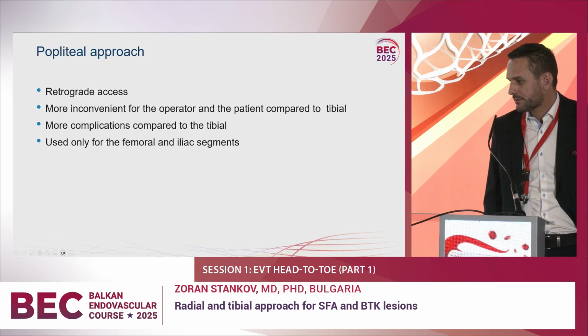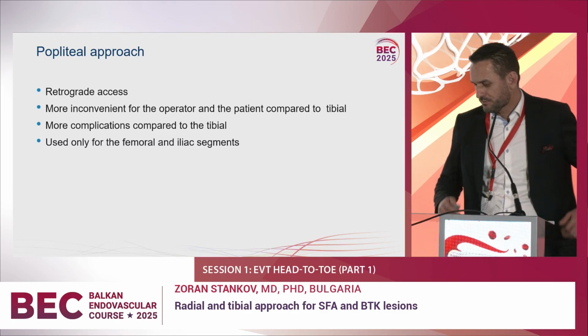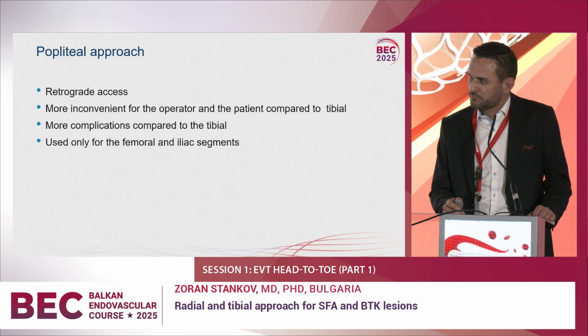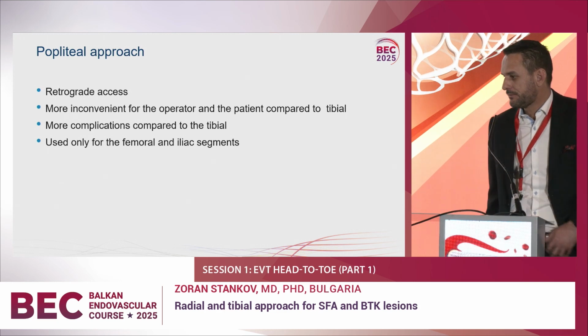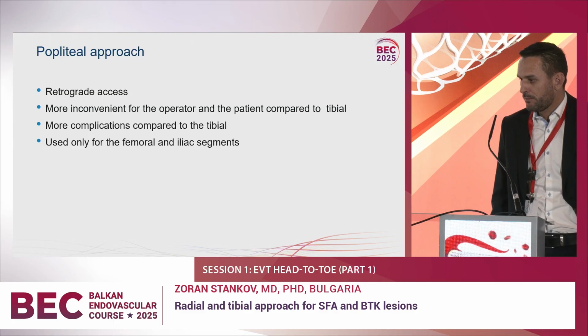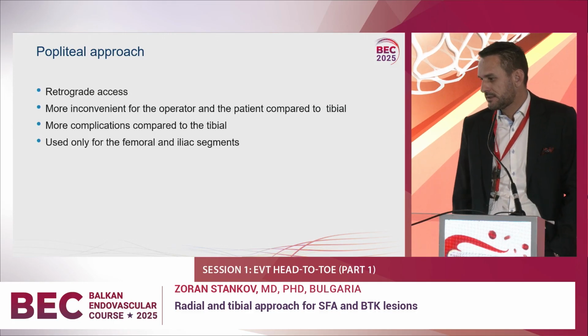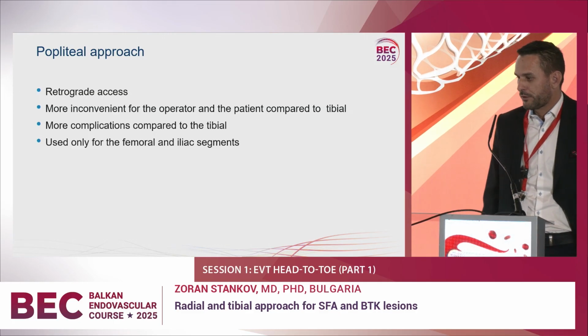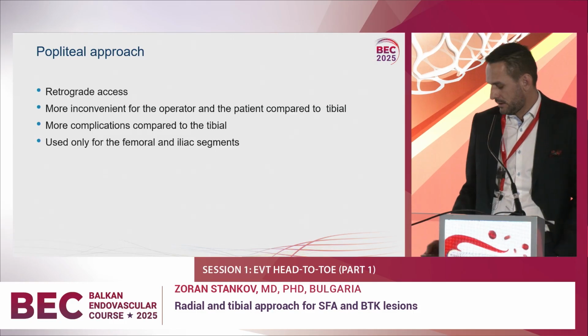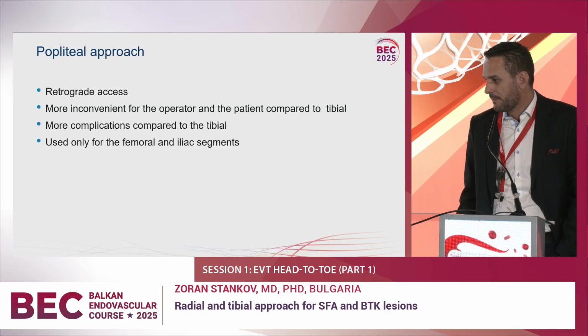Popliteal approach is a retrograde access, but it's less comfortable for the operator and for the patient compared to the tibial, with more complications compared to the tibial access, and it is used only for the femoral and iliac segments. It cannot be used for tibial artery lesions.